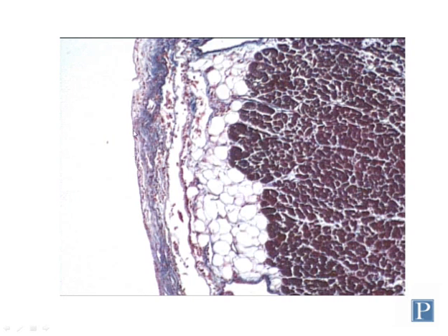So here you have the mesothelium. Deep to the mesothelium you have some connective tissue, and you can see some adipose tissue here. So if you see fat cells or adipose tissue, you know you're looking at the epicardium, not the endocardium. The endocardium is going to have the Purkinje fibers.